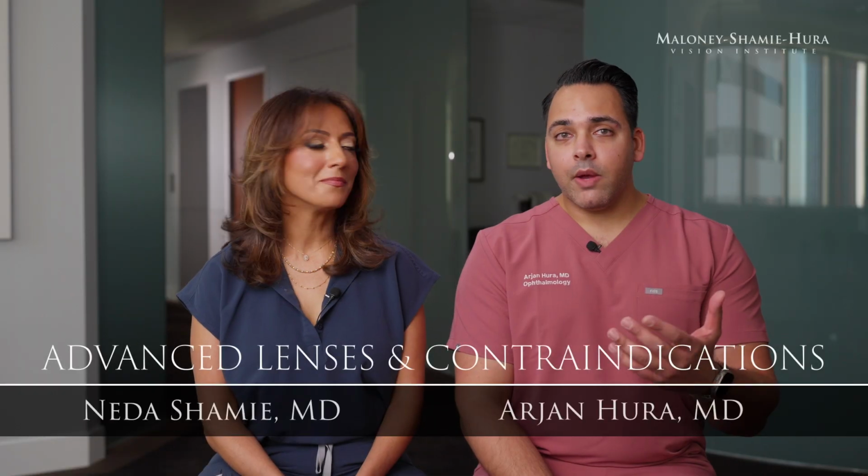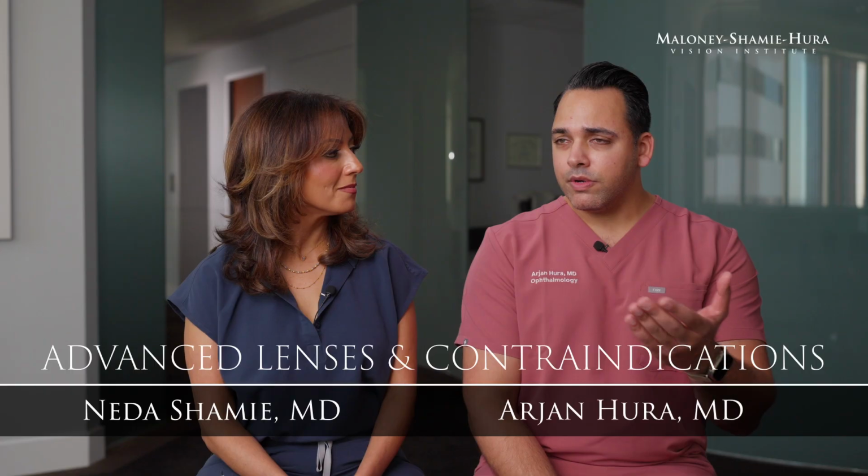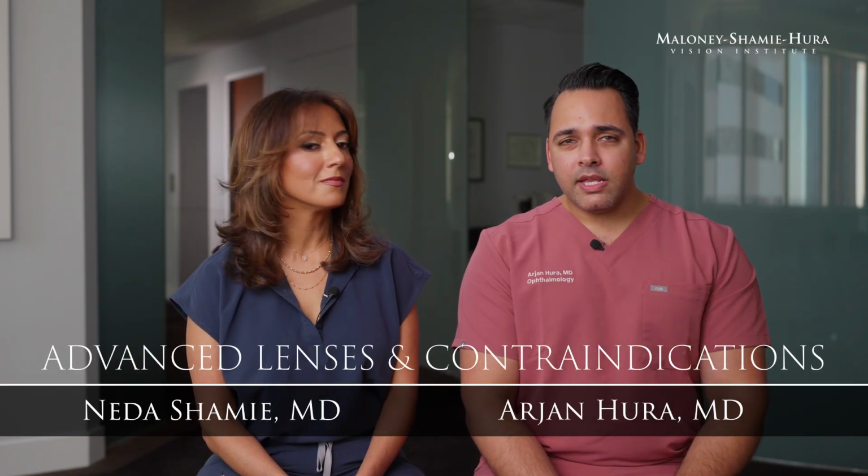As good as advanced IOLs have become, I think we can both agree not every patient needs an advanced IOL or is even necessarily an ideal candidate for those IOLs. And I think it comes down to a couple things. One, can we meet the patient's expectations if we're using an advanced IOL? And two, what is the patient's anatomy?